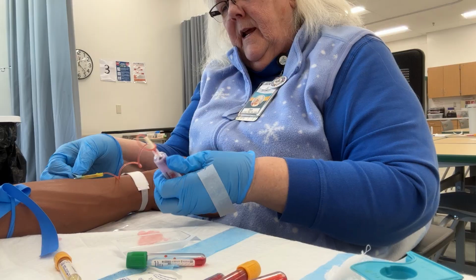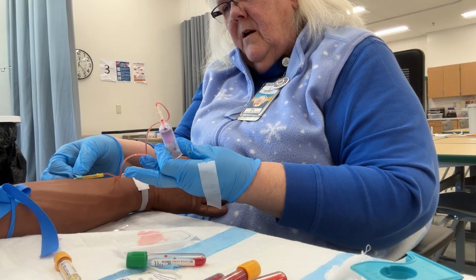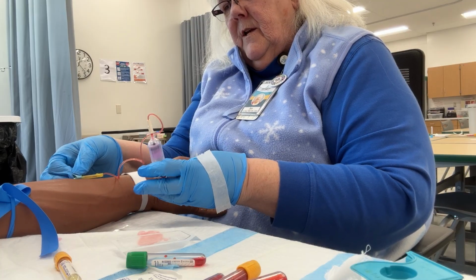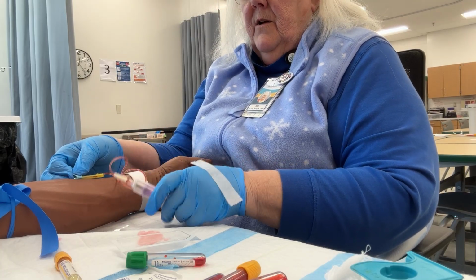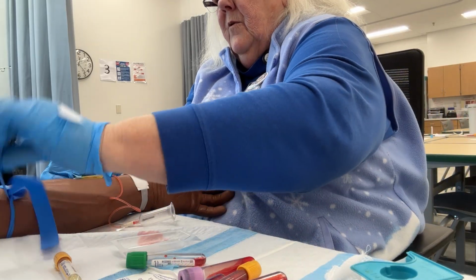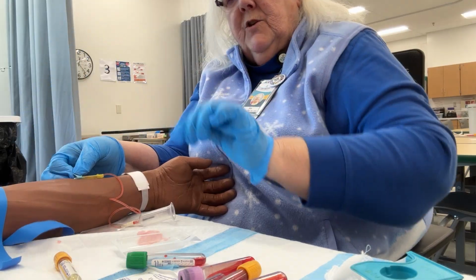You don't want to get air back in your tube. So another way, if you feel like they're slipping off, either get another tube, hold it, and you can also do all your tubes at the end. You need to pull the tube off before you take the needle out. You also need to remove your tourniquet.